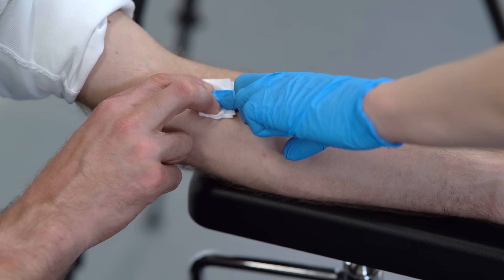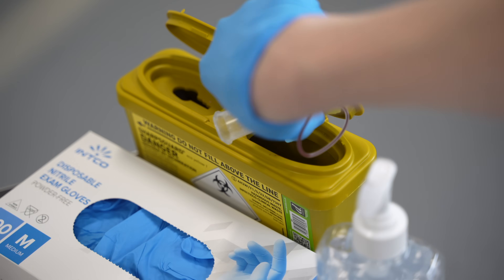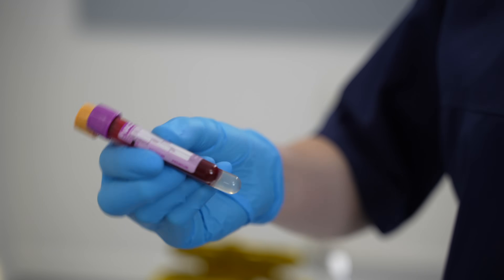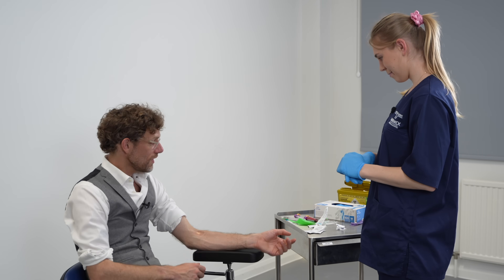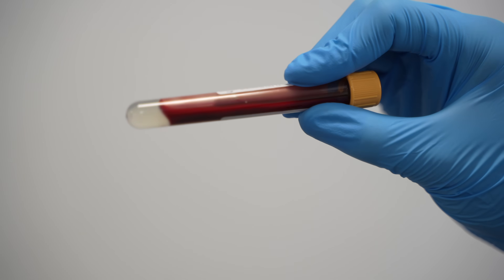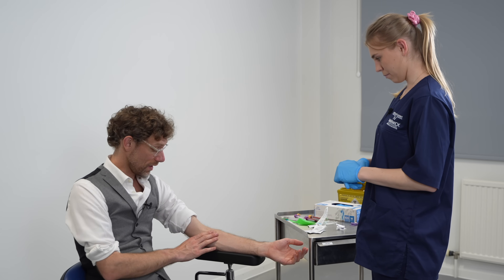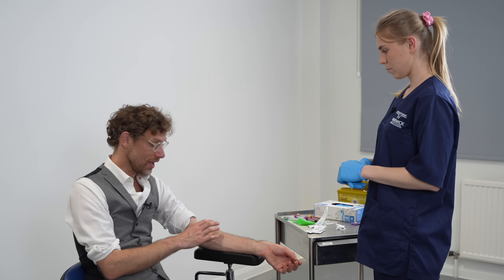You ask the patient if they could very kindly hold the gauze down — unfortunately you can't do this with patients that are untrustworthy. Make sure that you put the needles in the sharps bin afterwards. Make sure to invert the bottles five times so that all the components in the blood tubes get mixed with the blood. You'll notice on the gold top bottle that the blood has clotted — this is supposed to happen in that bottle, so that's fine. Tell all patients to press as long and hard as they can on the wound, because that will prevent extravasation of blood under the skin and prevents bruising.